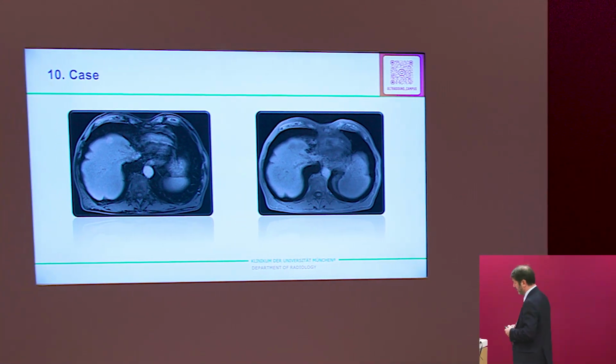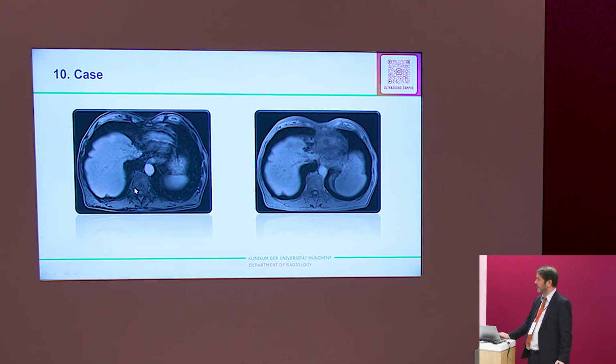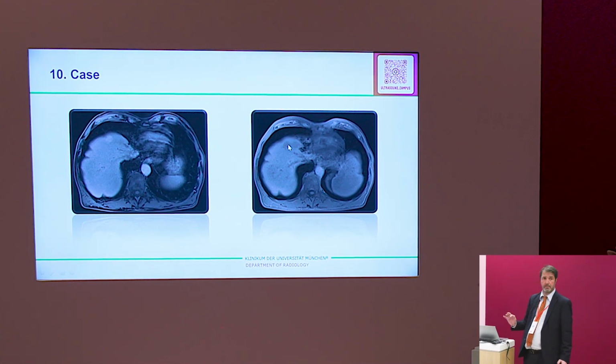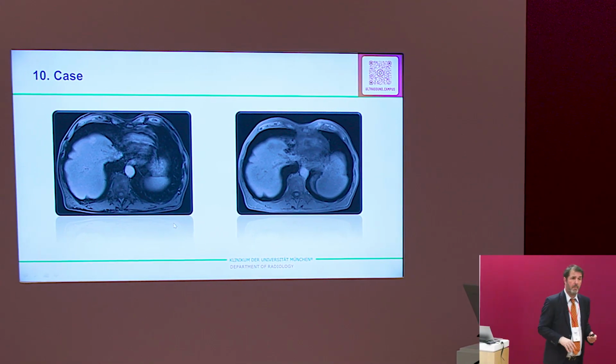You see very nicely, in the MRI there's a lesion here, which shows a strong uptake, and later it seems to be dark. So if you only have these 2 images in the MRI, your diagnosis will be mets.